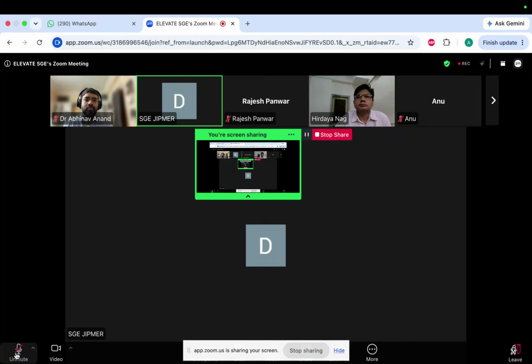And take the anastomosis at the tip of the vein. Don't take too much thickness of the vein wall. And the other thing is the clamp on the renal vein: when you put it, always make sure 2/3 of the renal vein wall is included in the clamp. Otherwise, if you include only 1/3, when you take the anastomosis, you won't be able to take a bite. And if the clamp suddenly moves a bit up, you won't be able to take the bite and you will miss the anastomosis.